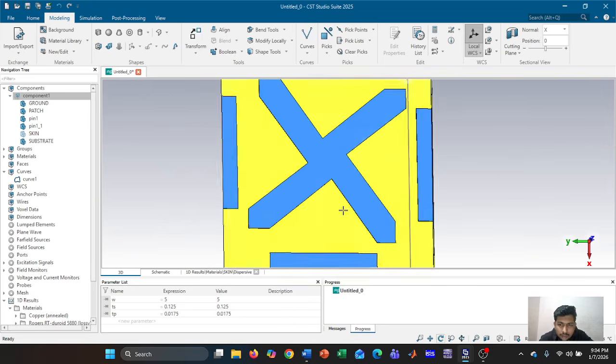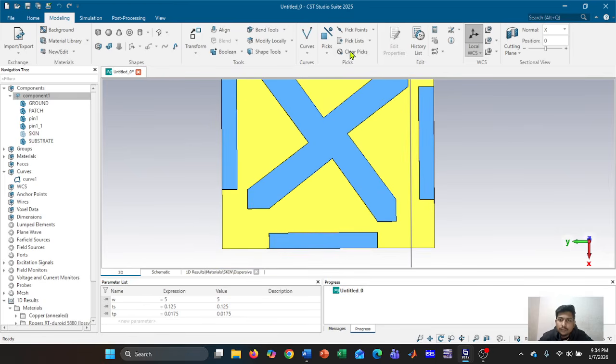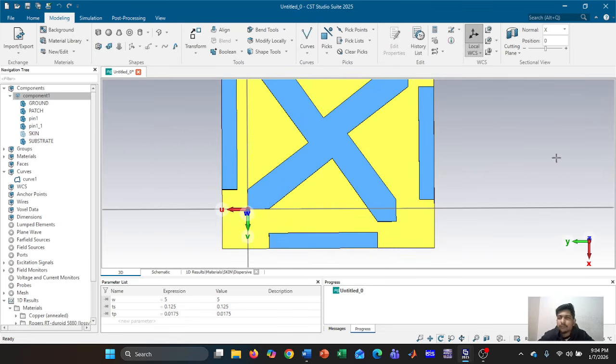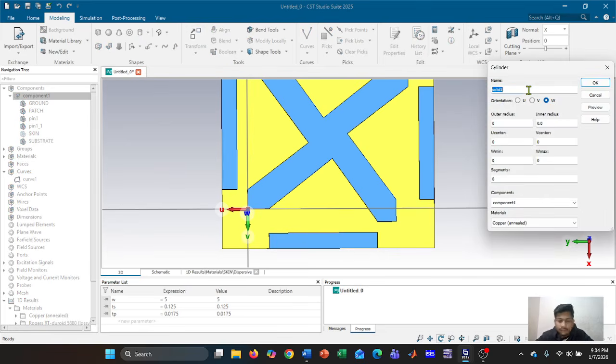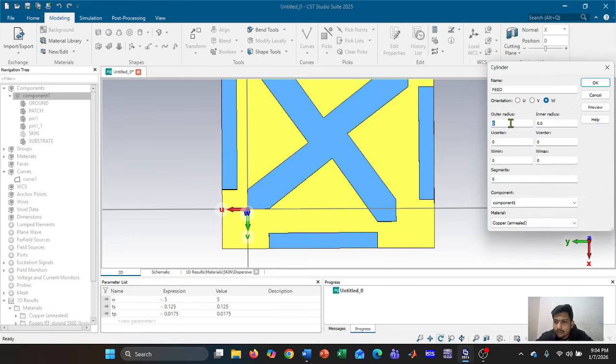Now I am going to design the feed. Again select local axis, let me select there. And now I can select the cylindrical shape. Let's name it as feed. Radius 0.5 by 2. Let's preview. Let's center it.